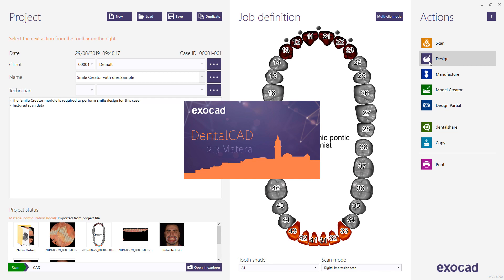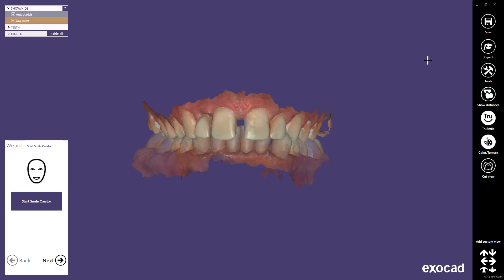The software automatically starts a wizard that will guide you through all the work steps. Click on the Start Smile Creator button to start.